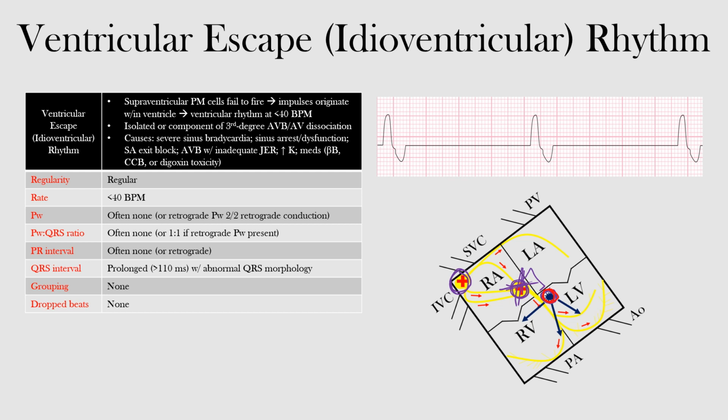So somewhere in our ventricles is taking over, and we have this place here. Let's just erase this so it's cleared. So we're starting from this area outside our conduction system, and we have this slow cell-to-cell depolarization that's depolarizing the ventricles all around outside our normal conduction system. So if things are slowed down, how does that appear on the EKG? Well, remember, going horizontally represents time.